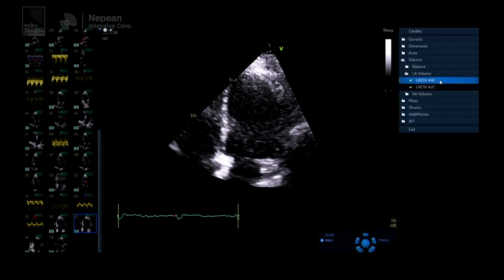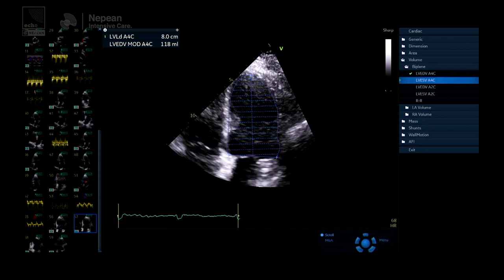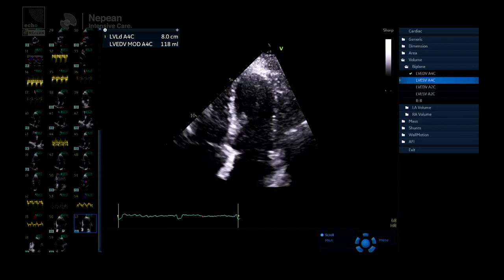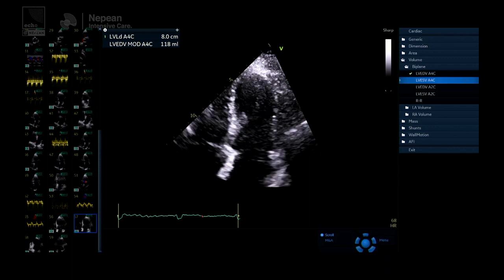We have an apical four chamber — it's a zoomed, focused left ventricular view. Louise, one of our incredible sonographers, is tracing the endocardial border on a difficult patient. It's really important and shows beautifully why we need caution, because it's hard to delineate the tissue-blood interface. It's important that you include the papillary muscles and any trabeculae — they're all part of the LV cavity.